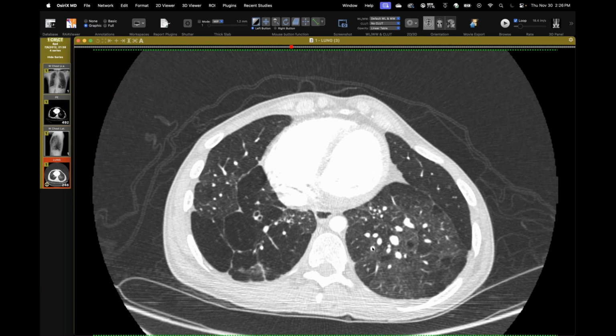Yes, when I was first shown cases of this in adults, I thought, what does this have to do with bronchopulmonary dysplasia? This is Swyer-James syndrome because of all the air trapping, and so all the other cases have conformed to that. But those are the findings. It results from prematurity. It's not really dysplasia. I mean, it really, right, yeah.